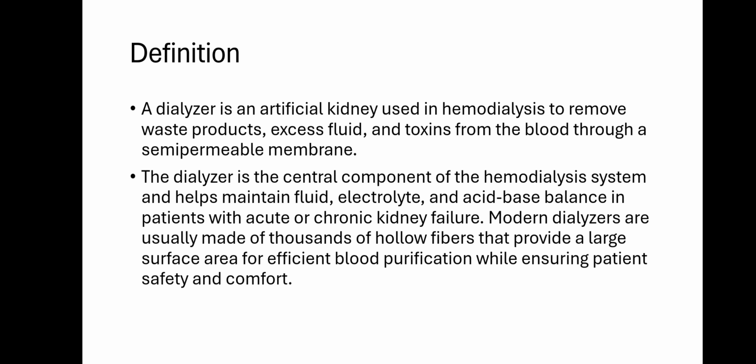Next we discuss the definition of dialyzer. A dialyzer is an artificial kidney used in hemodialysis to remove waste products, excess fluid and toxins from the blood through a semi-permeable membrane. It is called a dialyzer.